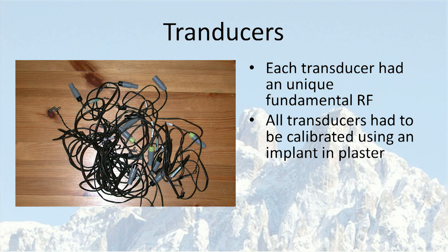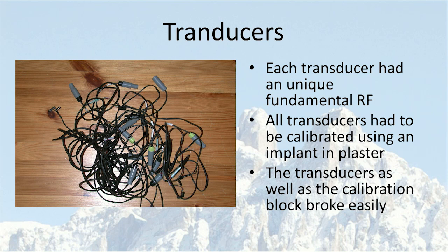Another problem was that since we had to sterilize these transducers, they were very brittle and broke often, as well as the calibration blocks broke. So we had a problem of keeping all the measurements on track. So there was a need of improvements in this sense.